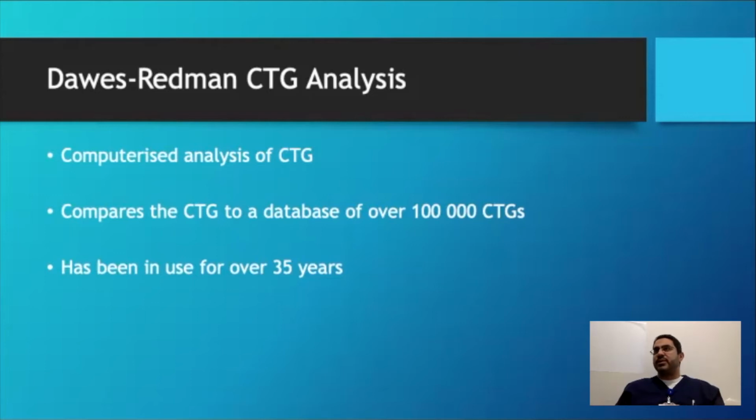That's all it's expecting. So if the baby's awake all the time, the baby's not getting any cycling anymore, okay, it's not going to pick that up. If the baby is not falling asleep anymore, it's not going to pick that up, even though that is actually gradually evolving hypoxia. Right? If it is not responding to contractions, it's not going to pick that up. It's not going to recognize that this baby is not responding to stimuli because it's not picking up the stimuli. So it is comparing rest to rest, not activity. So you can't use it with uterine activity. Does that make sense? Yeah.